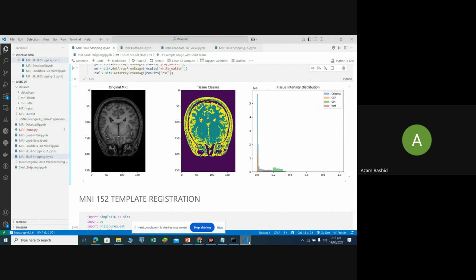Yeah, yeah. It's a one-step process. When we practically give the tool to hospital doctors, it is a step process, and while it runs you have a progress bar which also explains which process is completed and which is in progress. It's just a 1 or 2 minute process, and after that a report is generated in some visualization or plotting form, and you can download it in PDF format.